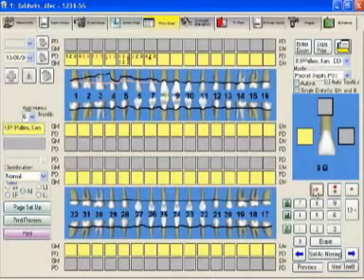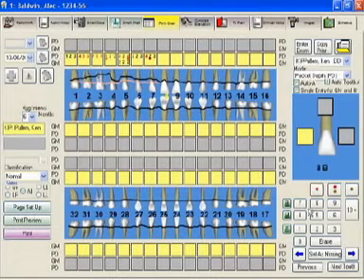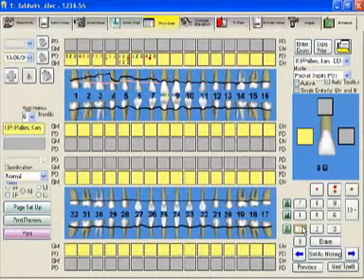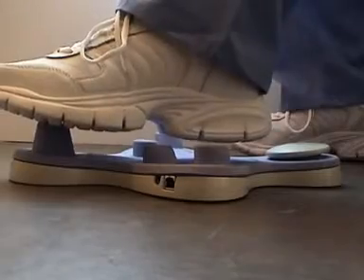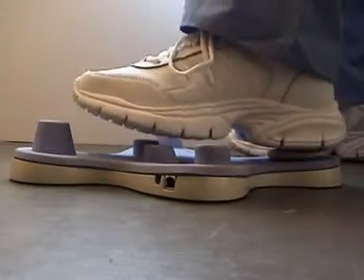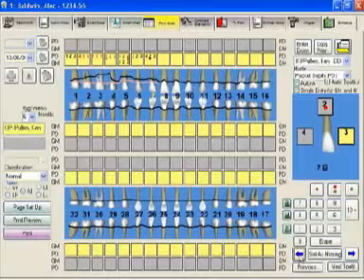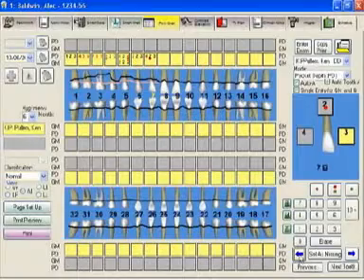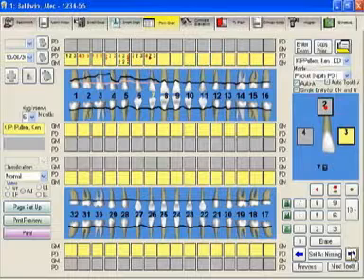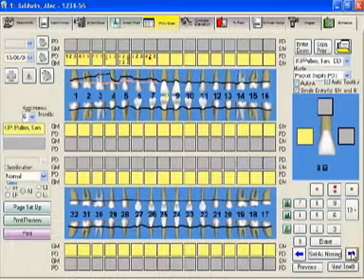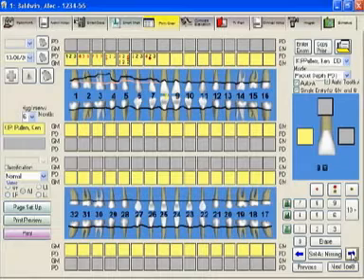If you make a mistake, you have your arrows down here at the bottom and you just mouse down to your arrows and you would just heel click. And they'll just back you up. Or if you need to go forward, you're just going to mouse over the forward button and it's going to make you go forward. But the more you get used to it and especially with the audio feedback where it repeats the numbers for you, you're not going to find that you're going to be making too many mistakes.